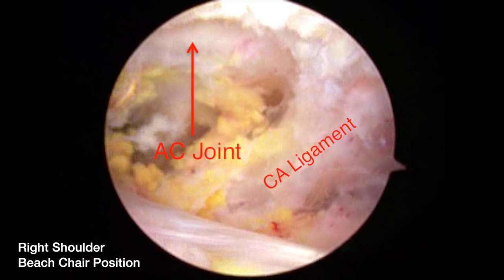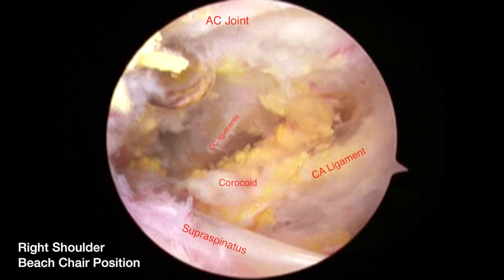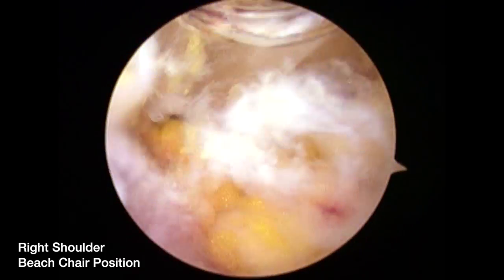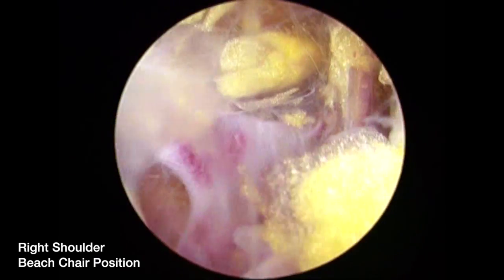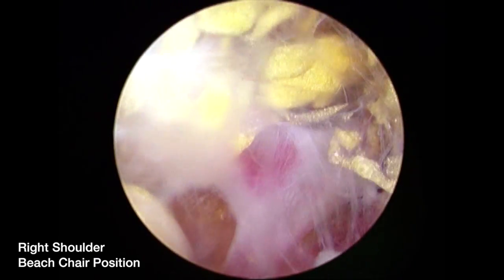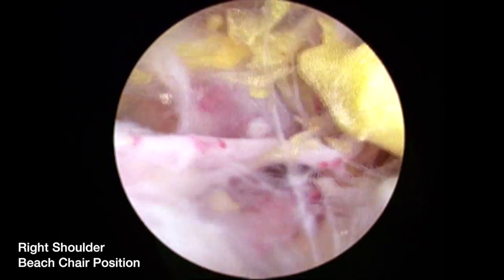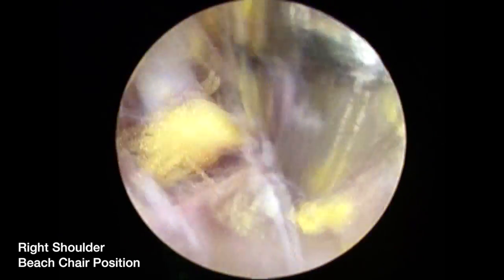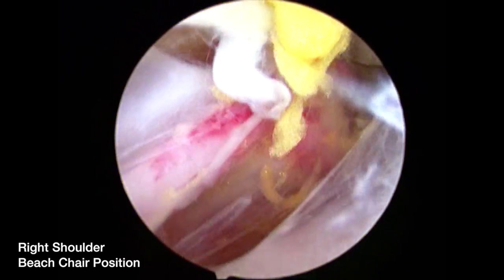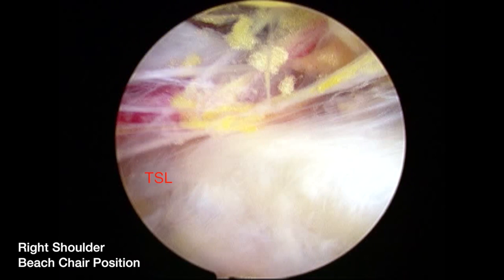At this point the AC joint is visualized, and the CC ligaments are seen in the background. These are branches of the suprascapular artery, with the scope in the posterior medial aspect of the shoulder. Further branches of the suprascapular artery are visible, and then the transverse scapular ligament comes into view right below the suprascapular artery. We continue to visualize the suprascapular artery, with the trocar again in the suprascapular nerve portal, confirming the transverse scapular ligament and the artery running above it.